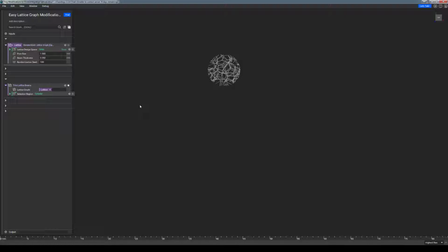Now this custom block was put together this way because more often than not, medical device designers are trying to ensure that their lattice beams do not escape or exceed a certain lattice design region. And, more often than not, they already have the solid bodies available to perform this type of trimming operation.